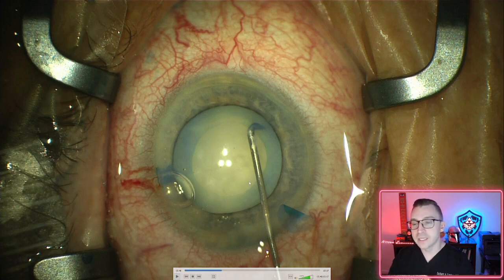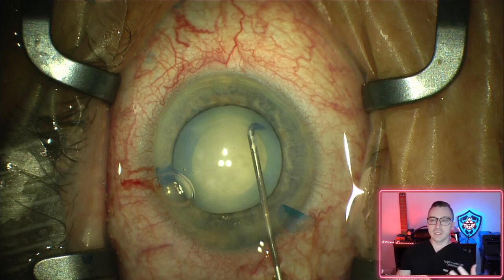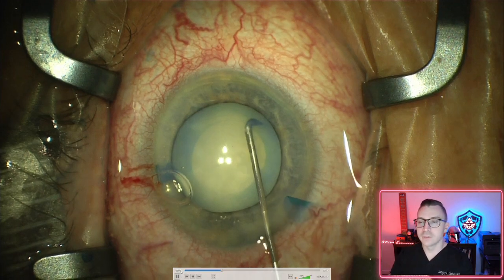So now what I'm doing is I'm taking another cannula and I'm going to inject some saline essentially down behind the cataract. And what that's going to do is separate the nucleus, which is the middle of the cataract, the core of the cataract, from the outer shell of the cataract, which we call the cortex. The reason we do that is because we want to be able to rotate and spin that center material of the cataract to allow us to deconstruct it more easily. And further, leaving a little bit of cortex back there too almost serves as a little buffer to protect that very thin capsule that we were talking about earlier, especially on the backside. And so that's what we're seeing here.